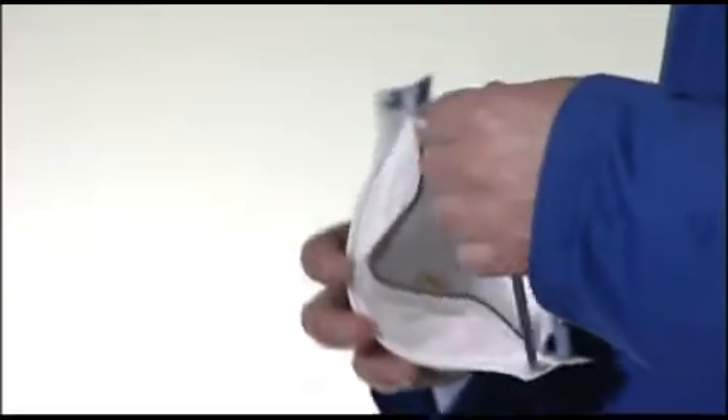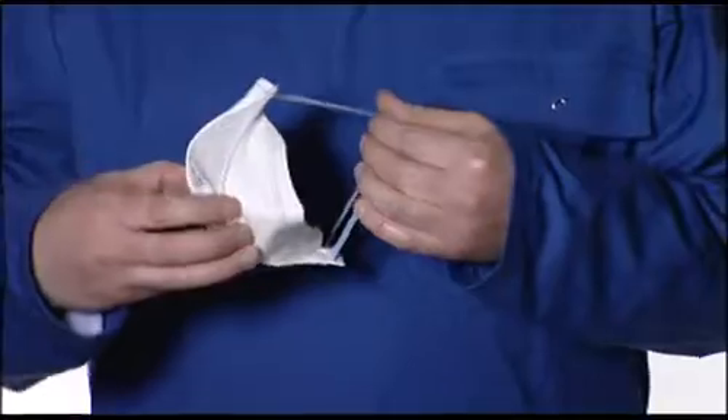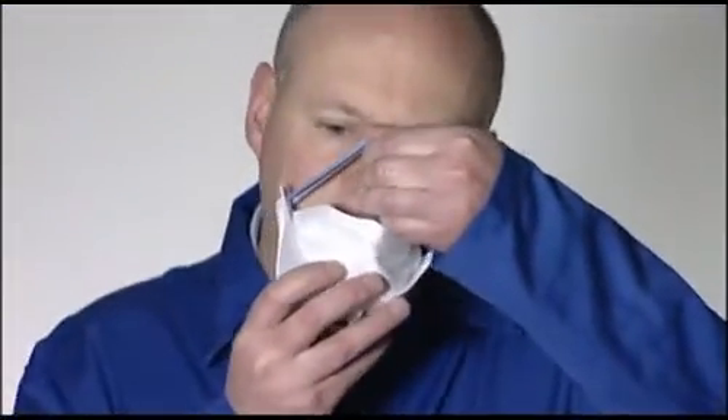Cup the respirator in one hand with the open side towards your face. Take both straps in your other hand. Hold the respirator under your chin with the nose piece facing upwards and pull the straps over your head. Locate the upper strap across the crown of the head and the lower strap below your ears.